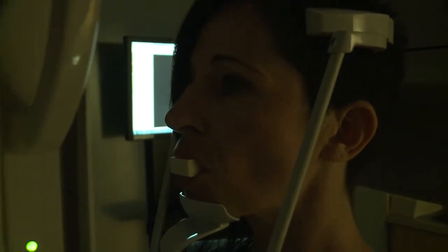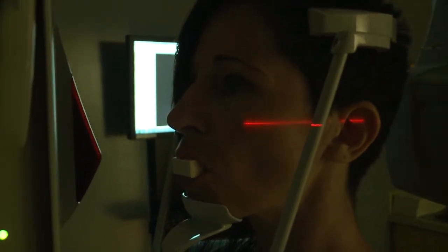One PAC system is for intraoral imaging and the other is for cone beam CT imaging, and we are one of the only schools in the United States where this technology is available at every clinical site within the whole dental school. Our role as teachers in oral and maxillofacial radiology is to prepare all the students so that they have competency in all technologies when they leave the school.